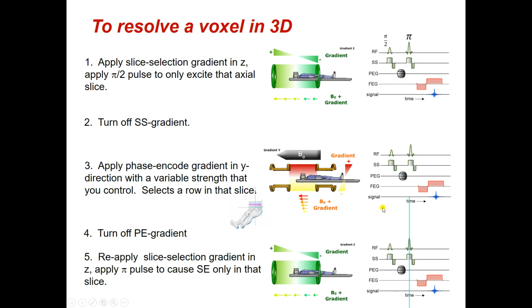Now, what do we have to do? Ooh, it's getting complicated. We have to go back and remember lecture 25, right? What was happening there? Well, we're trying to do the spin echo sequence. So now we need to apply this pulse, which is your pi pulse, because you're wanting this echo to come in at time TE. So at time TE over 2, you apply your pi pulse, just like before. So all this stuff had to come in between there. So this is at time t over 2, even though it's not labeled here, which means we're going to expect another echo coming at time t over 2 after that. Is that right? That has to be.